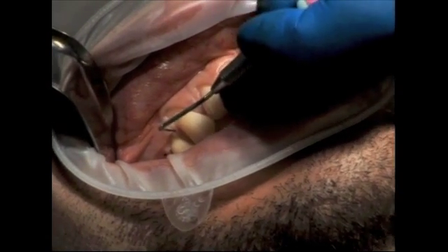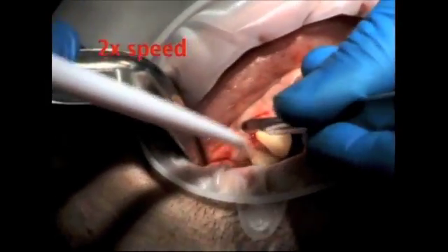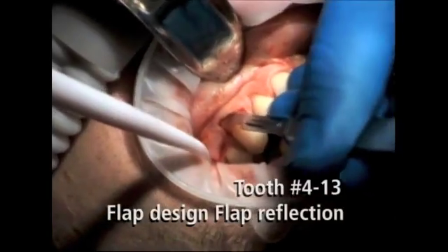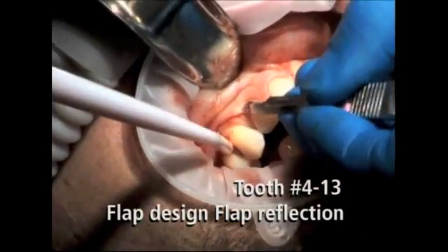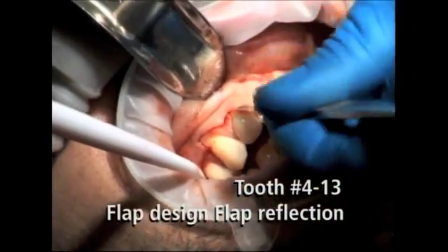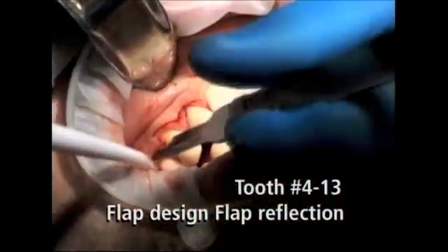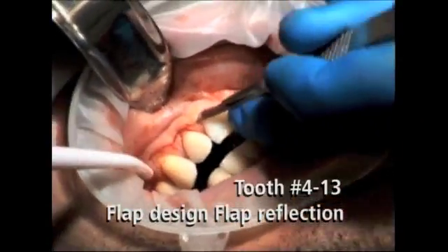The surgery begins by making bleeding points with the periodontal probe at a point apical to the tip of the papilla. A number 15 blade is then used to connect the dots — the bleeding points at the base of the papilla. Scalloping is made with the number 15 blade, with the tip of the blade directed at the crest of the bone. It is important that the initial incisions are sharp, neat, and well-defined, because this flap will later be coronally advanced over the recession defects, thus creating the new gingival architecture.